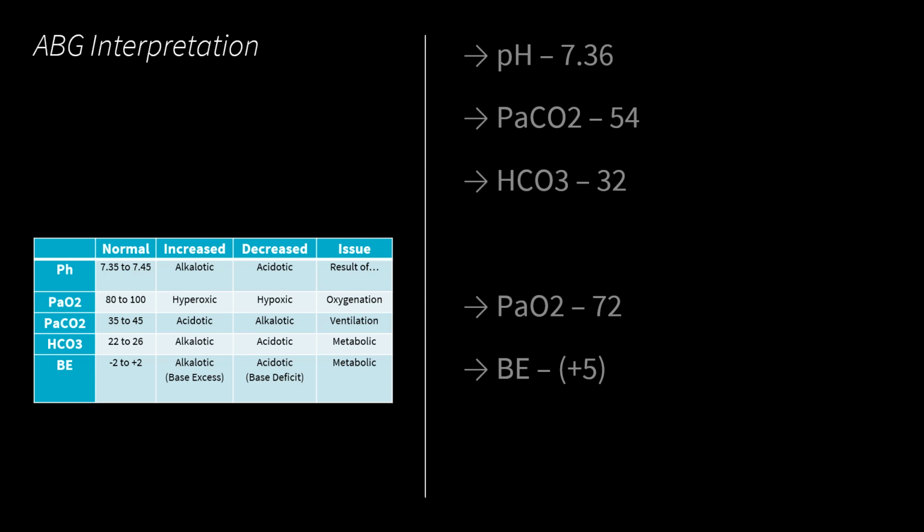So you look at that pH again and you ask, is it closer to being an acid or closer to being a base or alkaline? And so since 7.34 or a low pH would be an acid, you can see that the pH is closer to being an acid than it is being an alkaline. And that's gonna be important. So you're gonna label that as normal, but that it's also an acidosis. And it's, again, not an acidosis because pH normalized, but the pH disturbance that we're going to identify is going to have been an acidosis that the body compensated for.